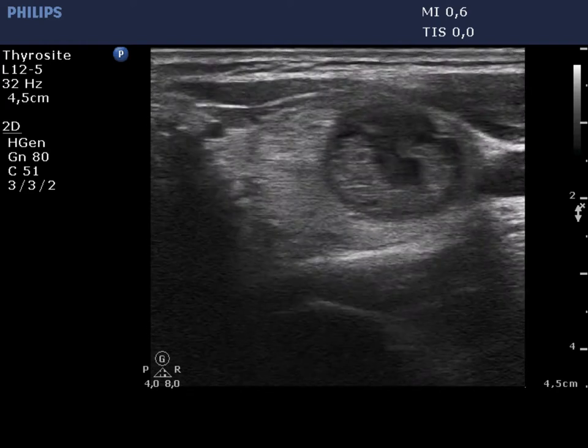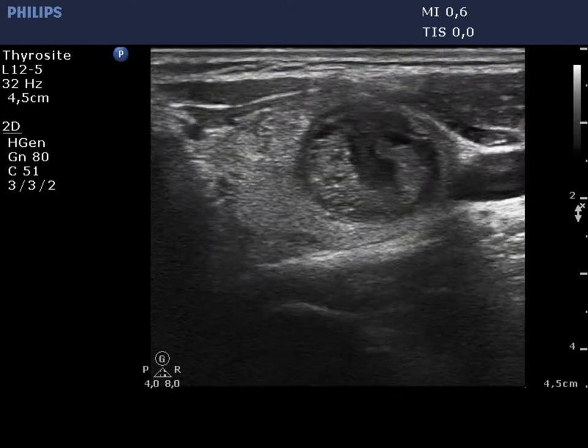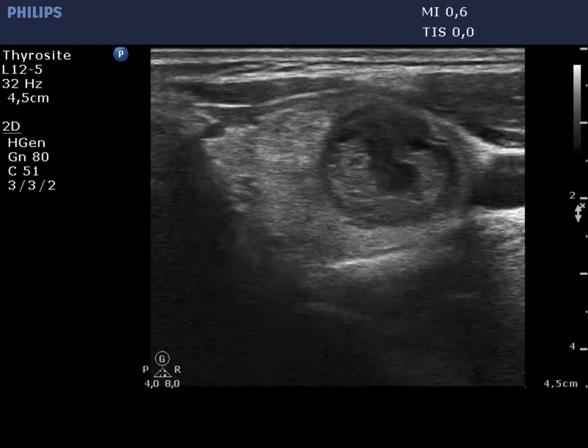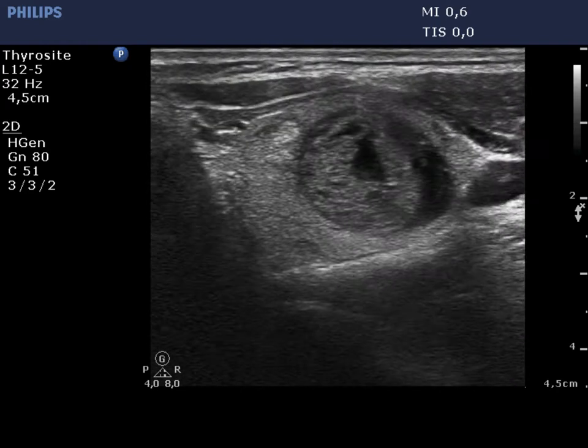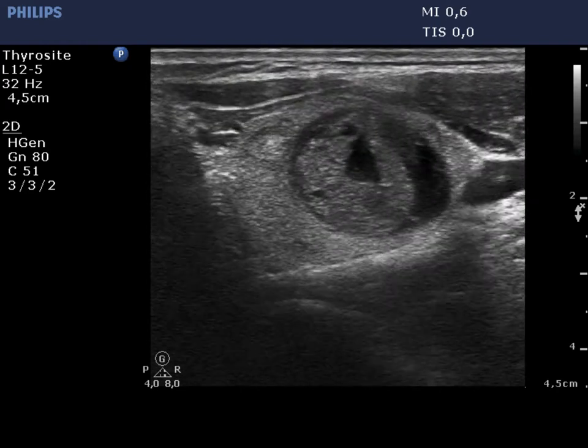Finally, a US-guided aspiration of the solid part of the tumor is demonstrated.